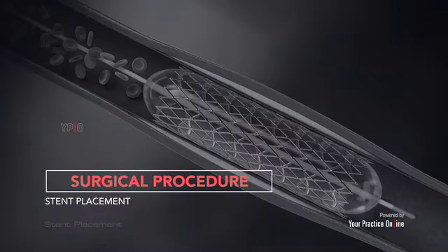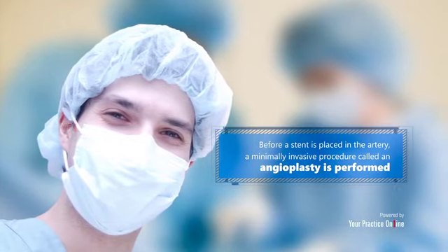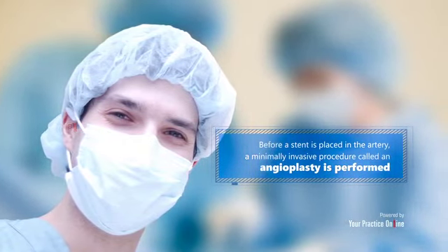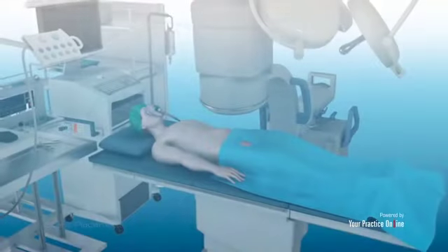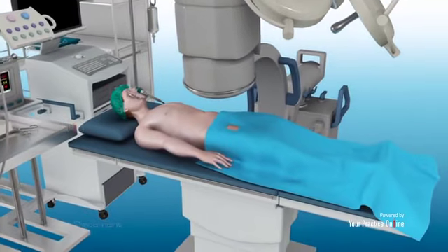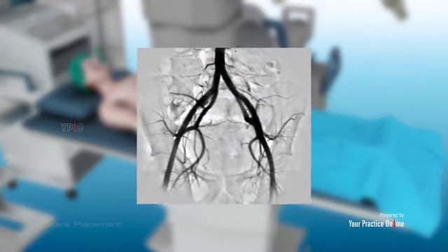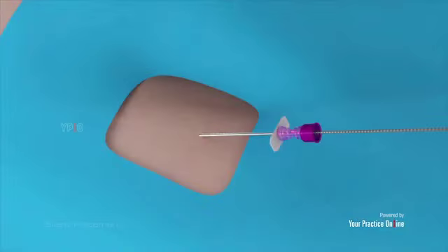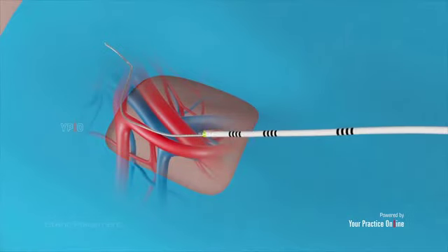Surgical procedure. Before a stent is placed in the artery, a minimally invasive procedure called an angioplasty is performed under local anesthesia. A dye is injected into the body to view the blood flow through the arteries, and X-rays are taken. Using these X-ray images, your surgeon inserts a thin guide wire through a blood vessel in the groin area and extends it up to the blocked artery with a small needle.